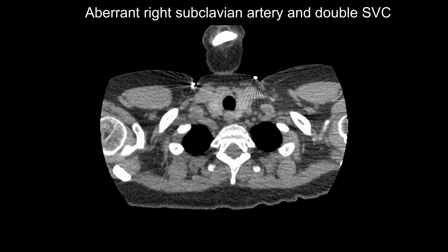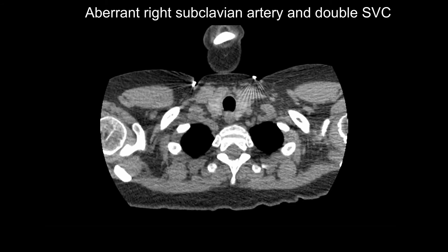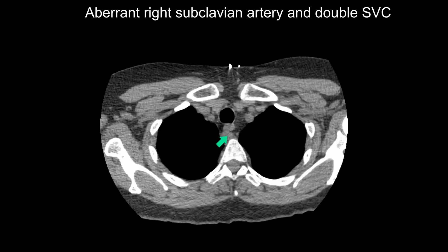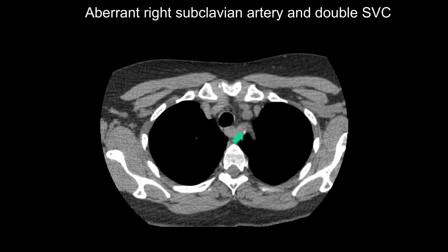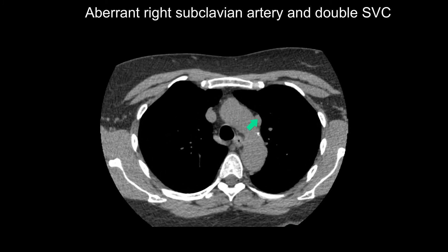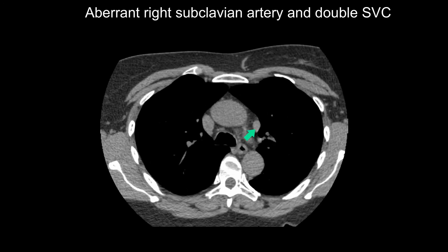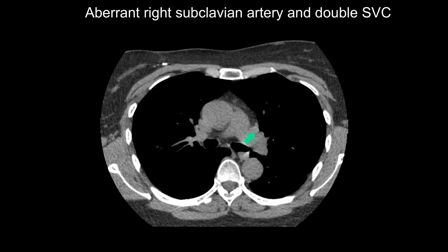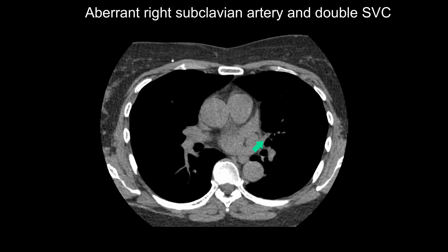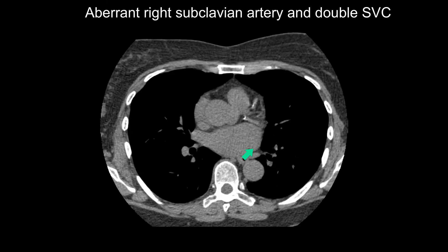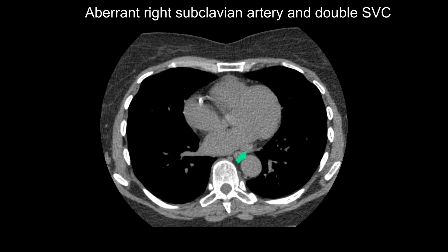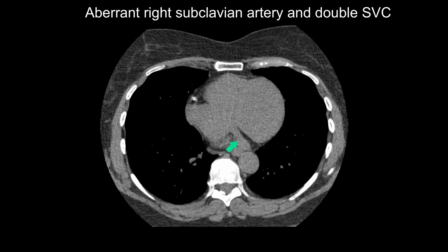Here is a patient who has both an aberrant right subclavian artery and a double SVC. Here is the right subclavian artery going behind the esophagus — it is an aberrant right subclavian artery. Now notice this vessel here which has just come off the left brachiocephalic vein. We've got a right SVC and a left SVC. Follow this down — it goes lateral to the pulmonary trunk, then jumps over the atrial appendage to lie behind the left atrium, and is going to insert into the coronary sinus.